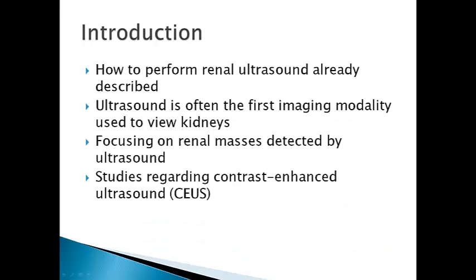So a little bit about what we're going to talk about today. Something I'm not going to talk about much is how to perform a renal ultrasound. There's already podcasts about that on the website. It's a little bit outside the scope of what I want to talk about, and it would be a little bit repetitive. So instead, I'm going to talk about masses that can be determined with ultrasound.